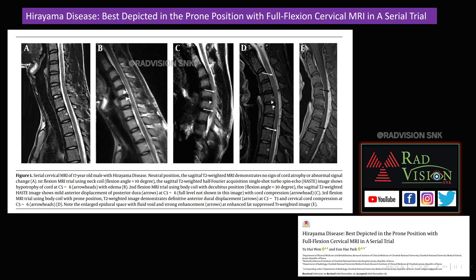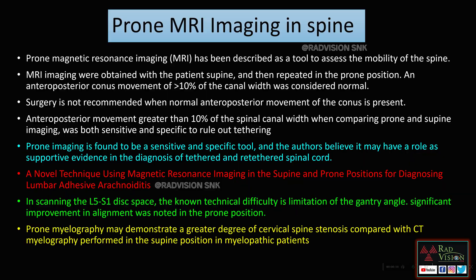This is a case of Hirayama disease. Normally neutral and slight flexion positions are used, but in patients where flexion is not possible, prone position with full flexion can be used. Cord compression, anterior displacement of the dura, and enlargement of the epidural space with strong enhancement are all better depicted in prone position with full flexion. Prone position with full flexion aids in diagnosing and better depicting findings in Hirayama disease.